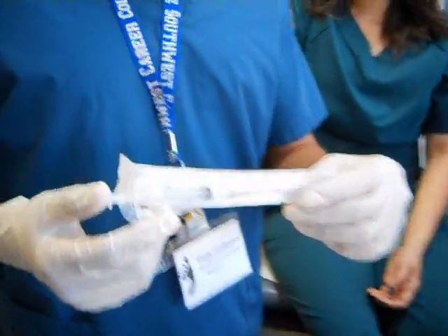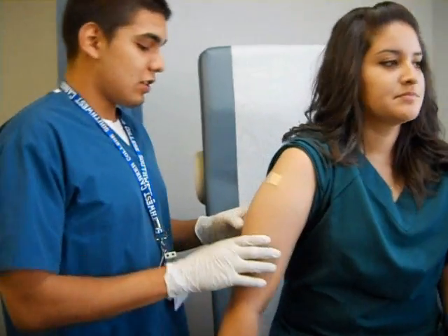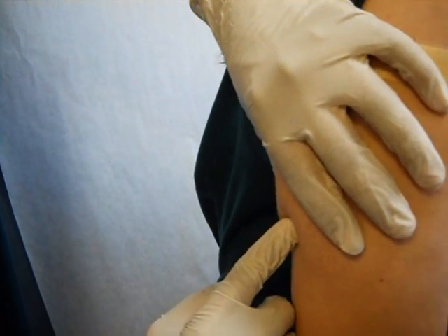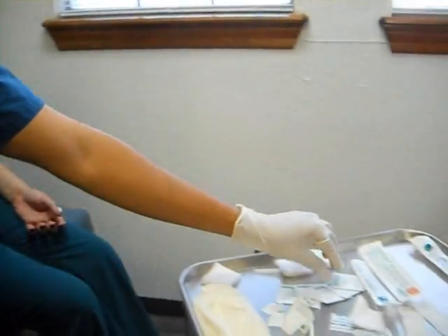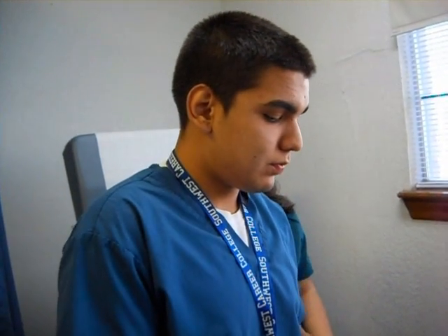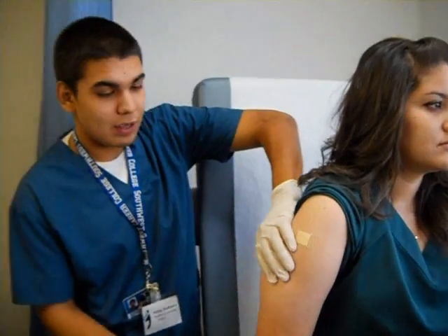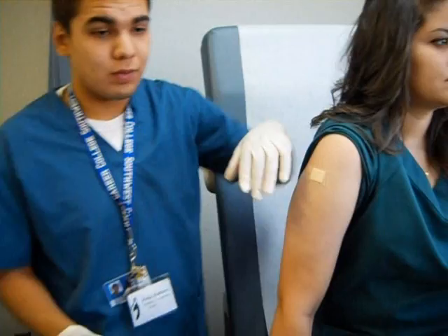This is your subcutaneous needle — the five-eighths inch. This injection occurs in the subcutaneous tissue and you want to get this area at a certain angle. Once again, get your alcohol wipes and wipe down the area. Be sure to let the alcohol dry so that no alcohol enters the system.